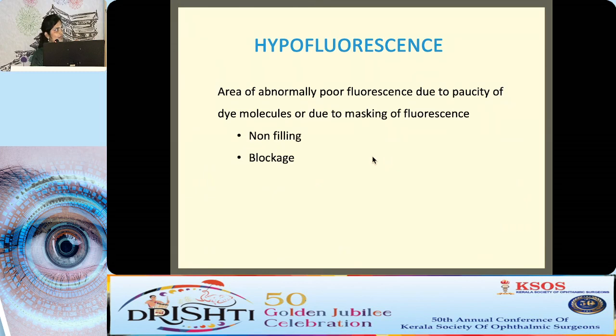Next topic after hyperfluorescence is hypofluorescence. It is an area of abnormally poor fluorescence due to the paucity of dye molecules or due to masking of fluorescence. It can be either non-filling or blockage.